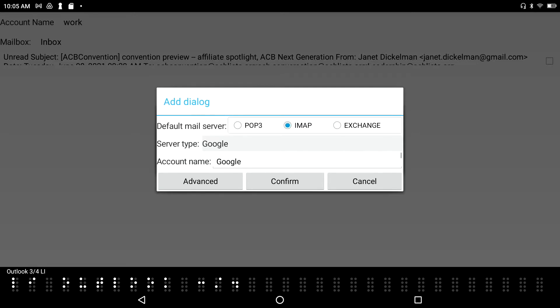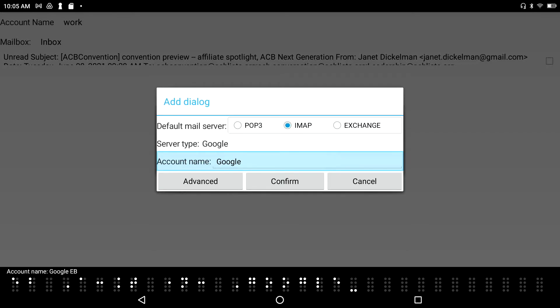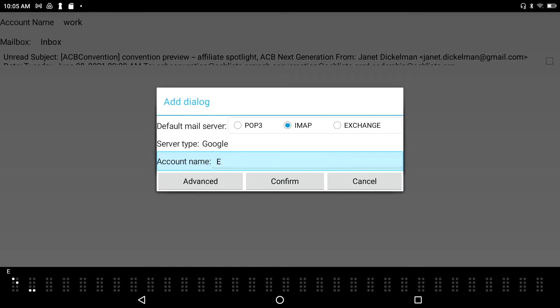I tab to the Account Name field, which is pre-filled with 'Google'. I rename it 'Earl Personal'. I have the input set to computer braille, and I can cycle between uncontracted braille, contracted braille, and computer braille using Space+G. I prefer computer braille when doing things like this.